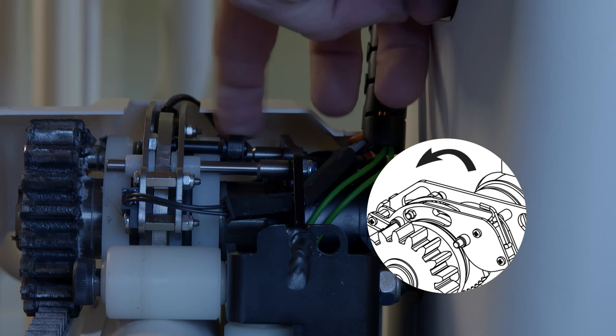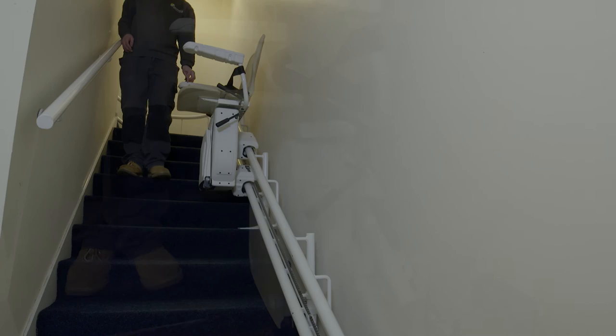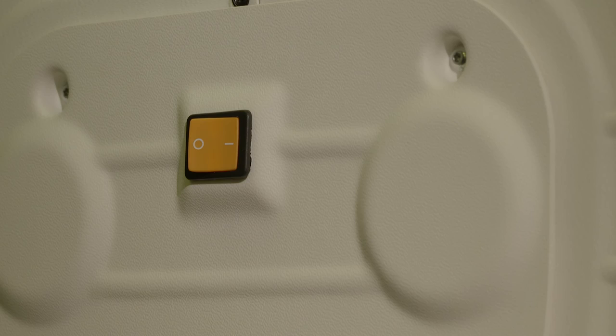Move the OSG arm into the neutral position. Then push the first and second PCB buttons. Then finally, reprogram the stairlift again by repeating the programming process.